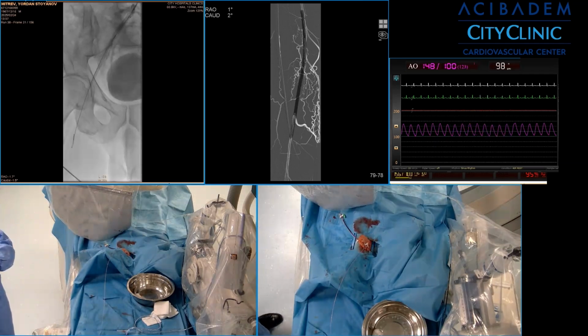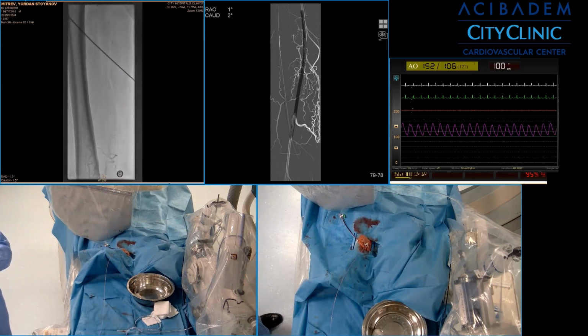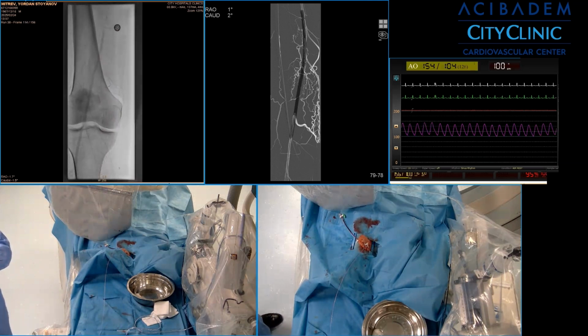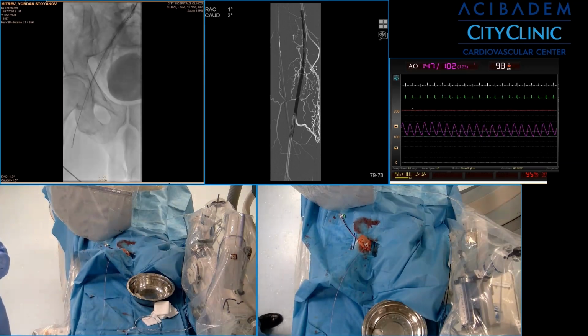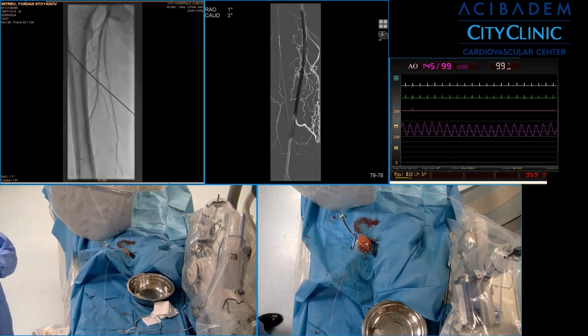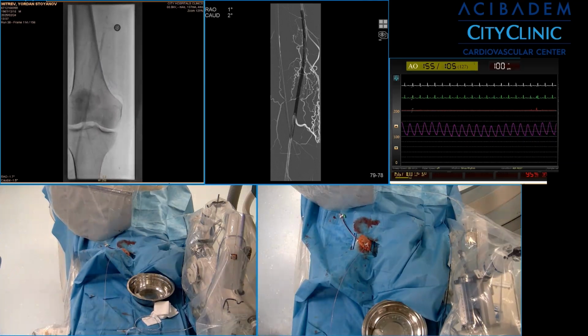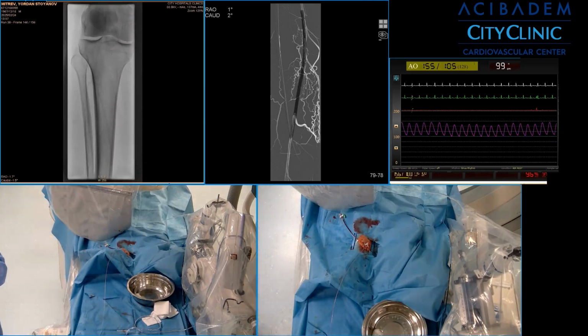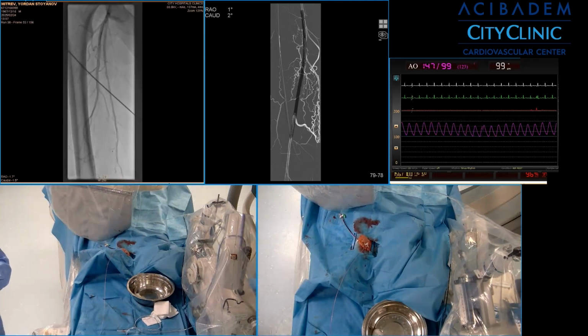We did a very tough case yesterday. You may believe it or not, but a 4-millimeter balloon looked bigger than necessary in a tiny lady, a smoker for 50 years. So what we are mentioning is very important in case you want to avoid stenting.